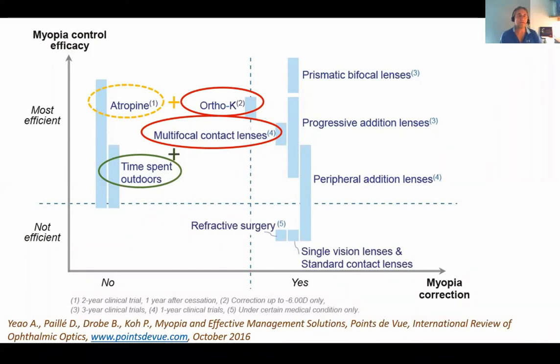And if we are not able to do this, we will use progressive addition lenses or bifocal lenses in glasses. There is some lens that is arriving from Hong Kong, they call it DIMS, that is very promising, not yet here. Let's see what happens with this. It will help a lot to have a good map of tools that will help us to control myopia, because not all children will be fitted with contact lenses, but most of them can do it very easily.